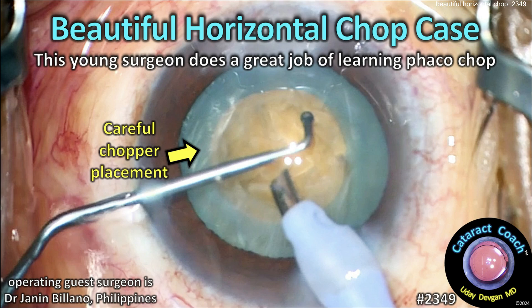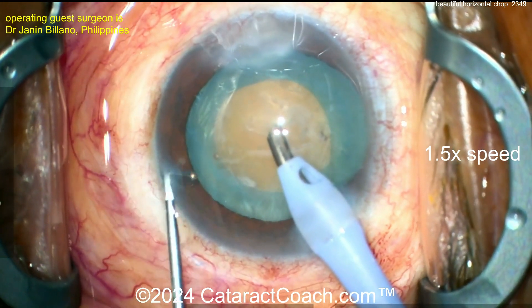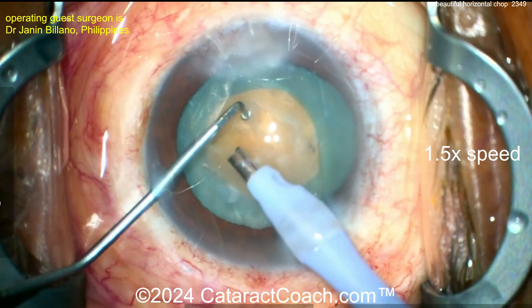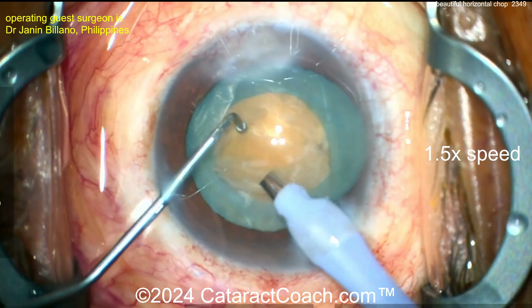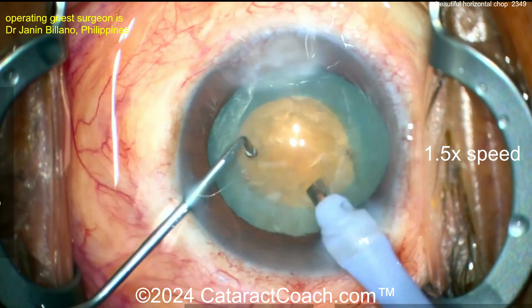cataractcoach.com — a beautiful horizontal chop case. This young surgeon does a great job of learning FACO chop. It's always a pleasure to see a young surgeon do a beautiful procedure. So let's go inside here — we've got a FACO probe and the right-hand chopper on the left looks like a ball tip chopper, cleaning up some of the anterior cortical material. That's all reasonable.